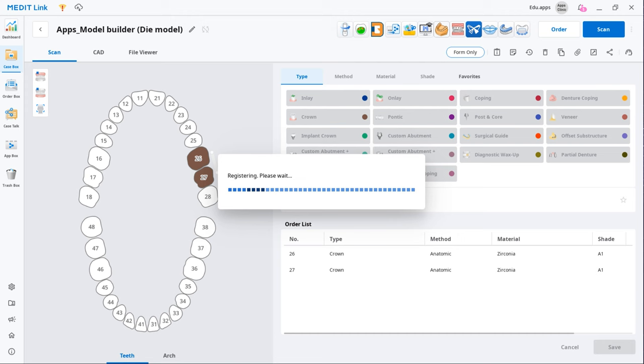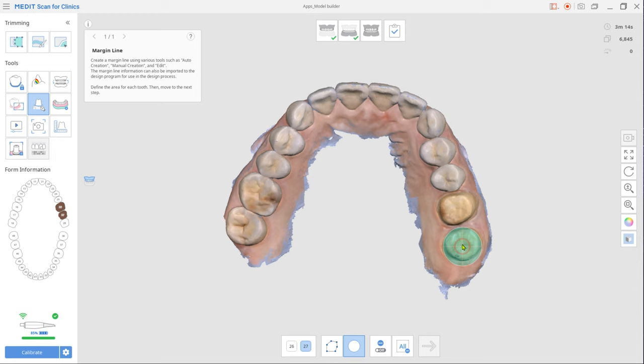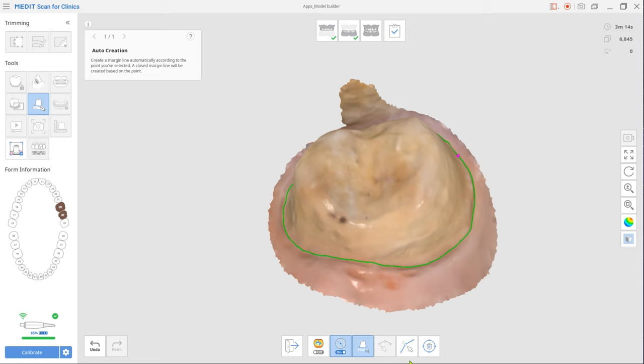A useful tip here is to create margins in MeditScan for clinics so they could be later automatically imported to Model Builder.